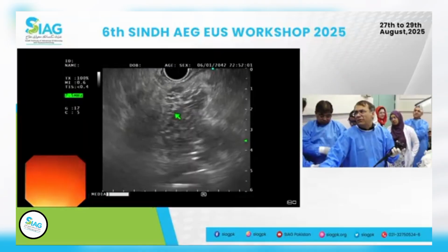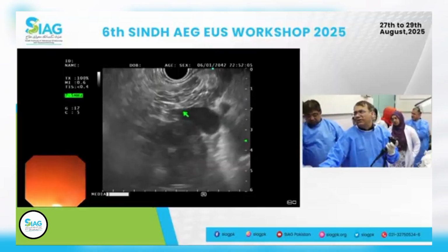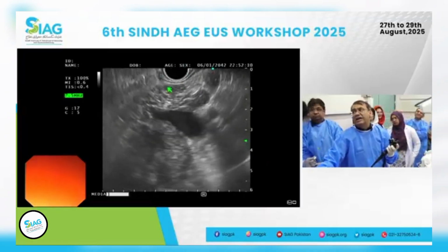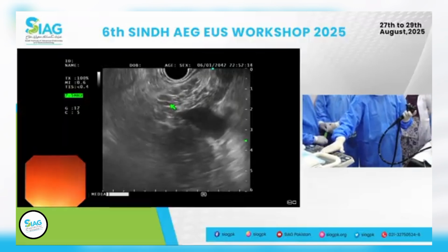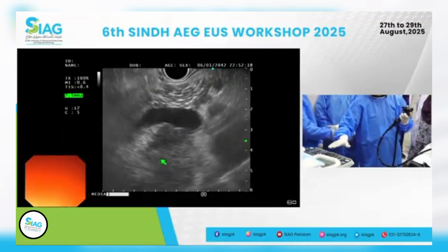We saw a glimpse of the pancreatic duct. Exactly, that's what I was pointing at, right there you see a nice pancreatic duct. It's not dilated, definitely, and I have made the image bigger too. On this portal vein, the neck area there, and in the head you see the mass itself.